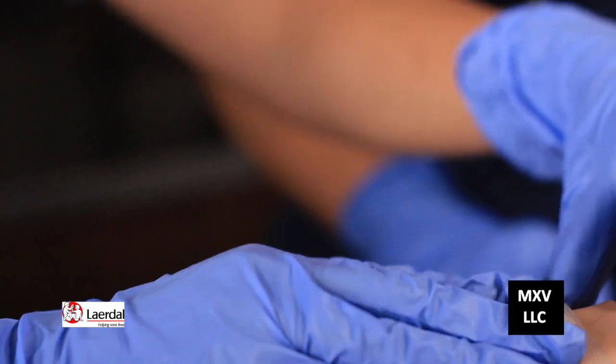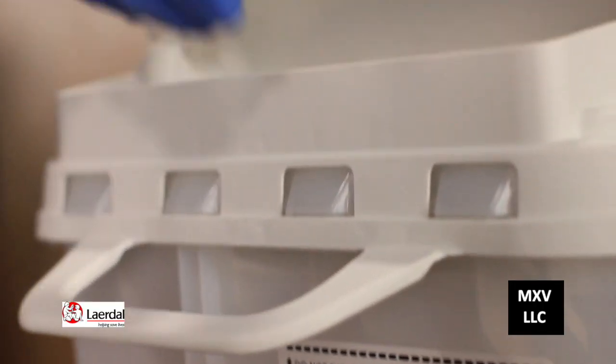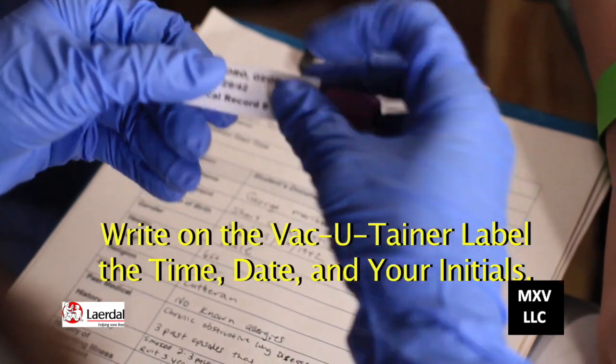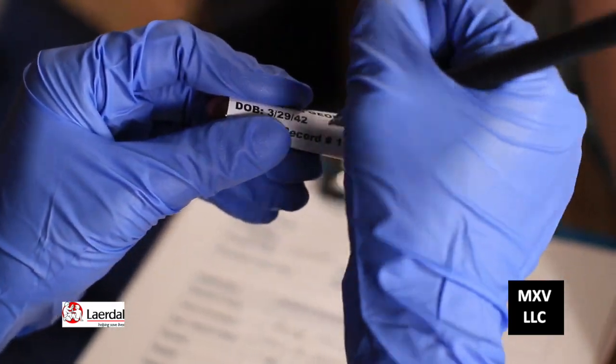Put some tape over it, and put this in the sharps container. At this point, we're going to take the vacutainer that we have the blood in, put the patient's label on it, then time and date it and initial it. Now we're going to take our gloves off, properly dispose of them, and then wash our hands. Awesome job, Holly — I couldn't even get it on my first try. Go ahead and report your accomplishments and complete the student simulation worksheet. And that's how you do venipuncture on a layer doll simulator.